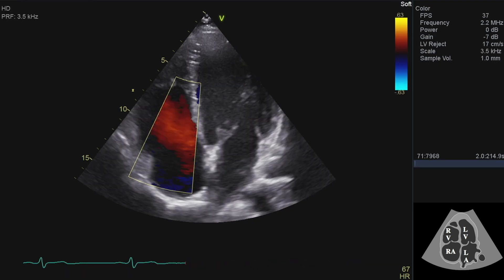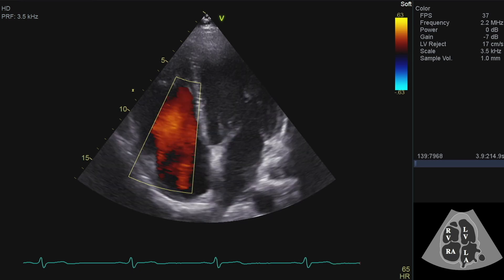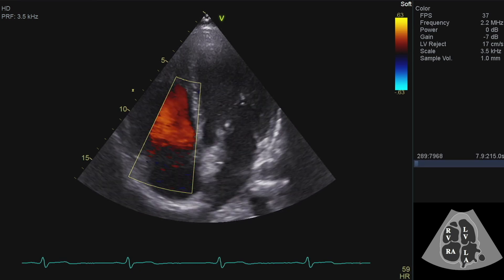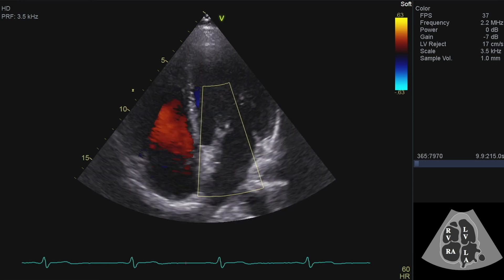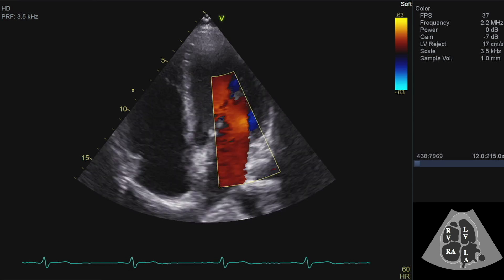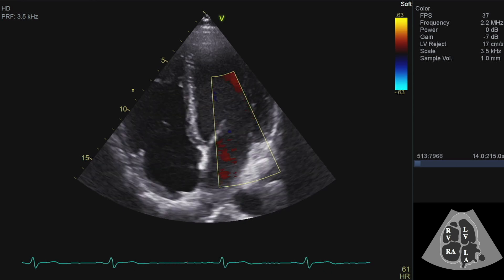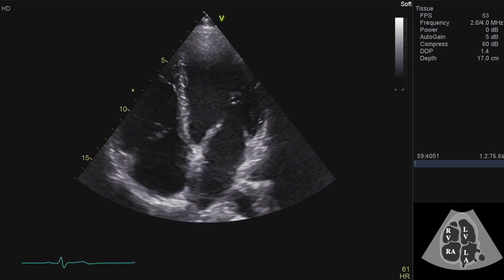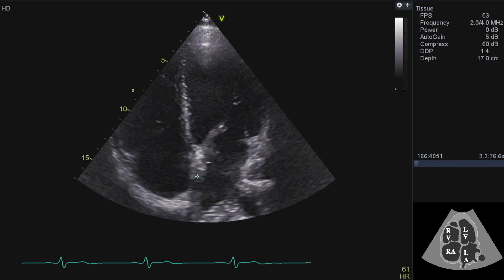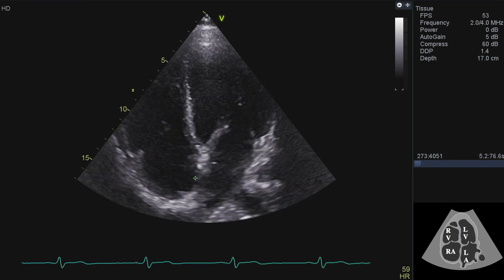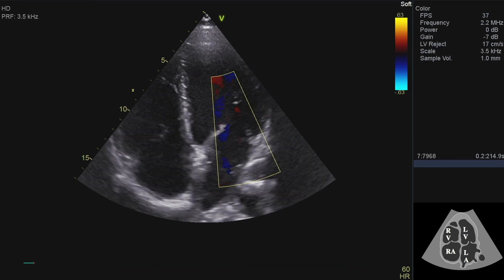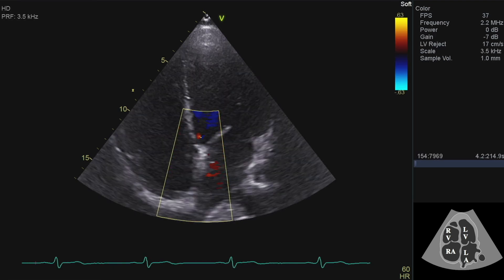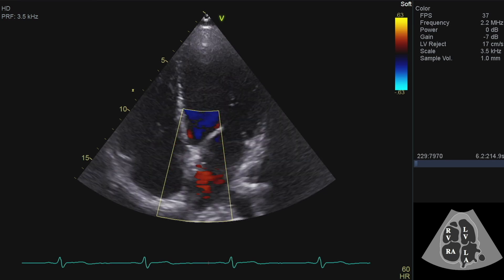I'll be putting some colour on like this. The red is forward flow through the tricuspid valve. I can't see any tricuspid regurgitation, and then I'll do exactly the same thing over on the mitral valve. I can see the interatrial septum quite well, but I'm not very well lined up for flow across it, so I'll probably want to look in a subcostal view to check if there's any ASD or PFO flow.